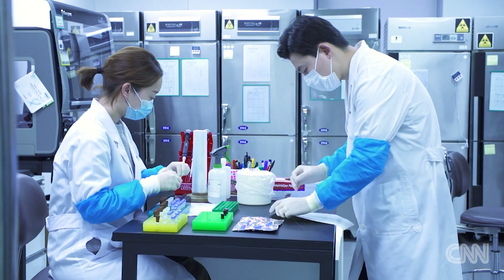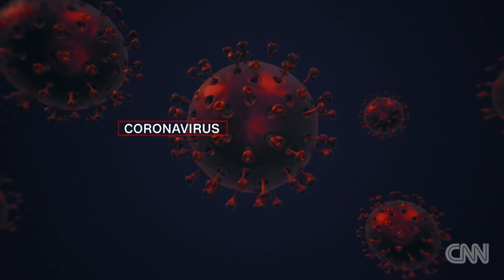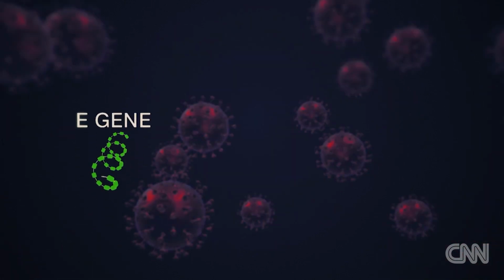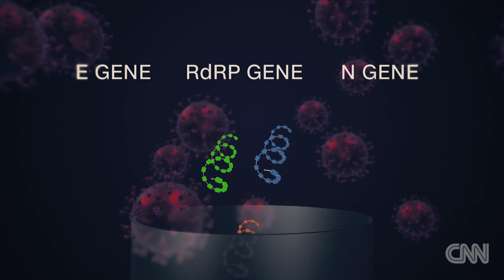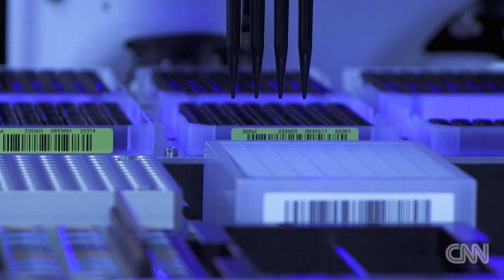The molecular microbiologists got to work without ever having a physical sample of the virus. Instead, they relied on a genetic blueprint of the new virus distributed by the World Health Organization and health officials in China, highlighting 3 specific genes. Seegene's scientists then had to come up with a way of spotting those coronavirus genes in future samples taken from patients. Was there more pressure than usual? "Yeah, because it's an emergency case, with the coronavirus rapidly spreading into our country."